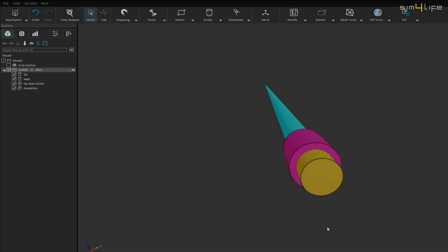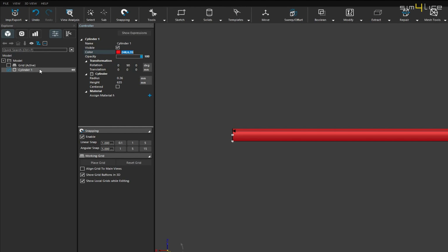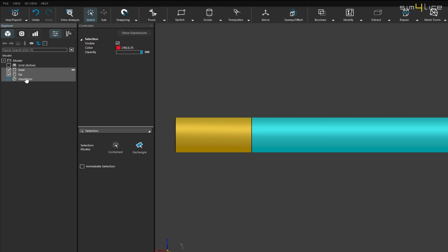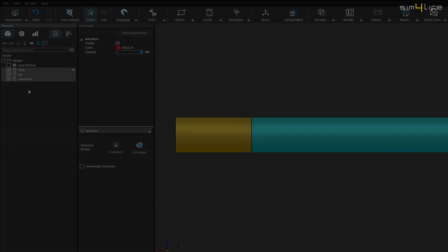We begin in the Sim4Life modeling environment by creating the numerical model of a standard active, implantable device. Initially, the core lead of the implant is modeled as a cylinder with a height of 635 millimeters. At the upper end, a second 4 mm cylinder of an extended radius is added to represent the tip electrode. The remaining part of the lead is then insulated by another cylinder of 1 mm radius.